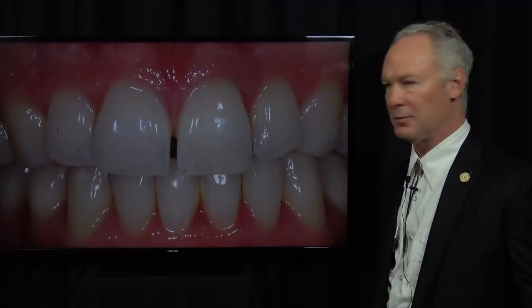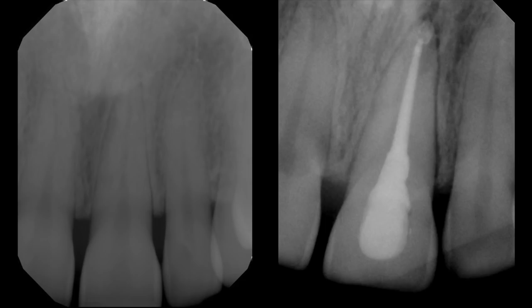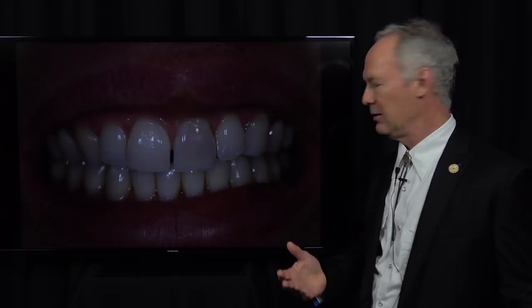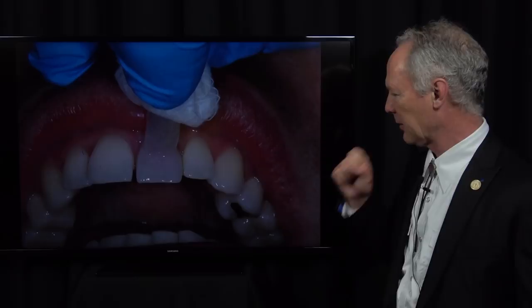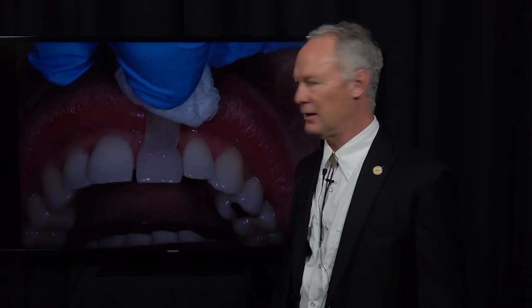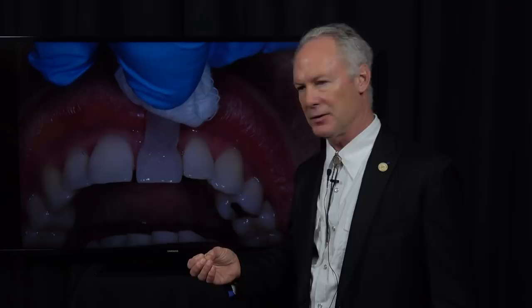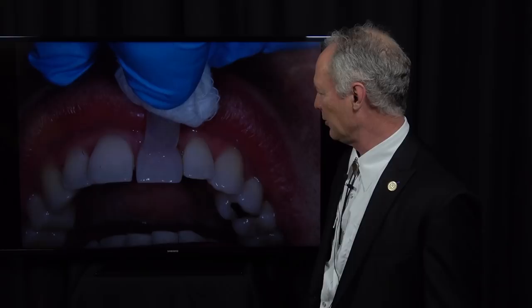Ultimately, endodontics was performed on the tooth. Chances are 99% the pulp is necrotic and will require endodontics. So I'm first ice testing it. We've shown this technique of ice testing — you just put some water in an anesthetic carpule with some dental floss in the carpule. You can refer to the Dental Minute video on that technique. Ice test this tooth and the adjacent teeth. Be sure that the patient is not responding to the cold on the gingival tissue — be sure he's responding to the ice on the tooth. This is a very good way to pulp test teeth in a simple way.